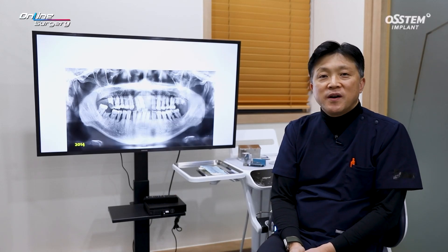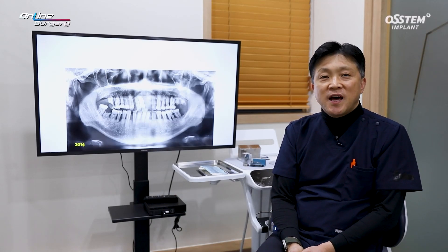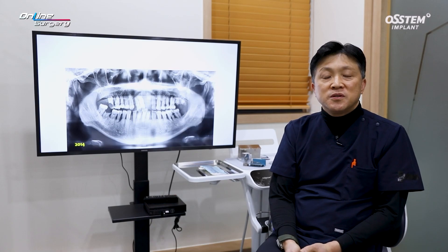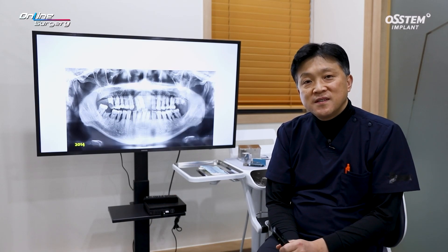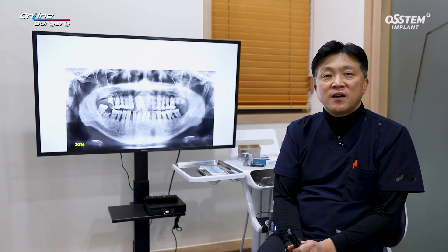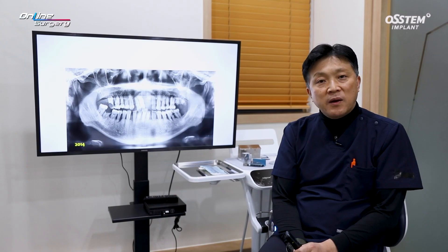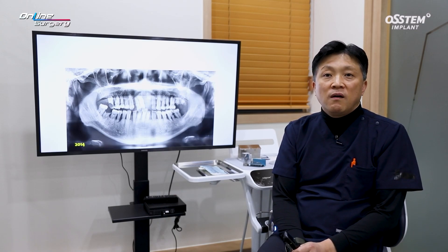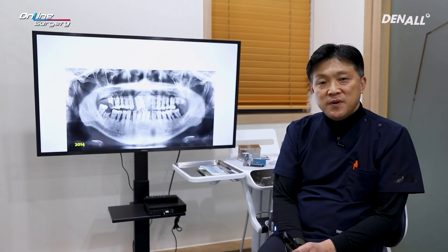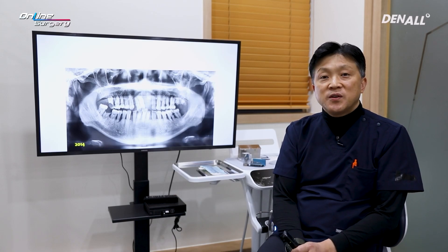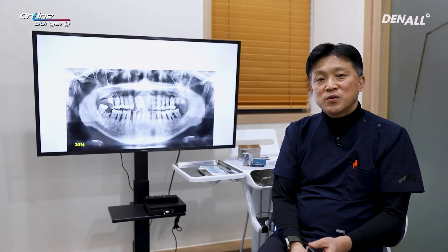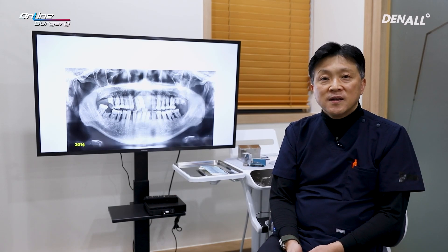Greetings, I'm Dr. Son Young Lee of EGOOD Dental Clinic. This is the surgical case of the day. After removal of a failed implant, because it was not viable to place an implant immediately, bone graft was done in the same way as ARP.